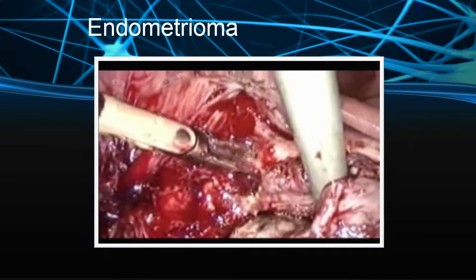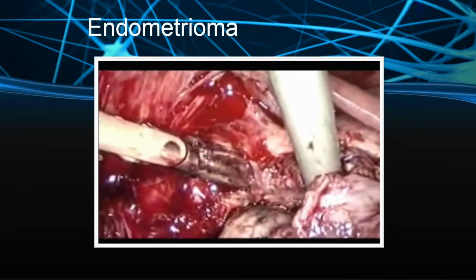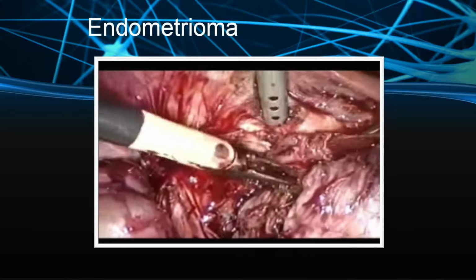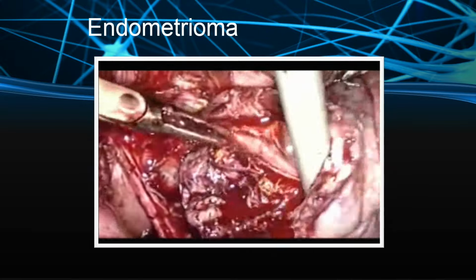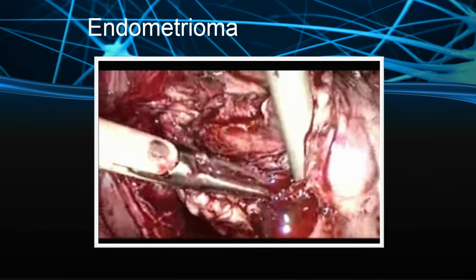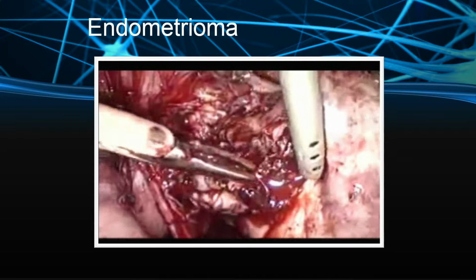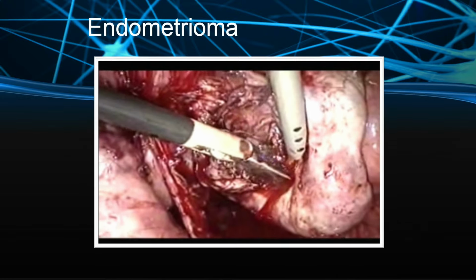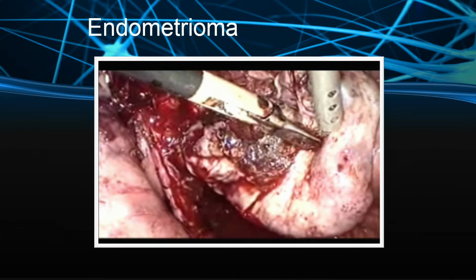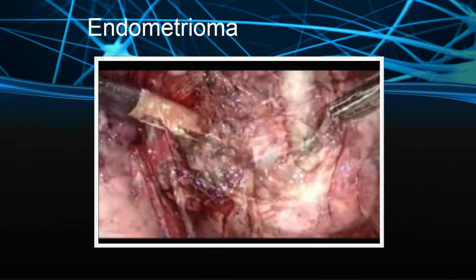So, these are very dirty cases. You should explain to the patient the prognosis, that I am doing my best, but your case can recur. This type of endometrioma, the recurrence chances are quite high. This is bipolar, doing vaporization; the margins you can burn, so that it will not occur again.